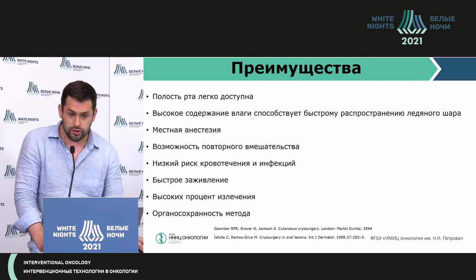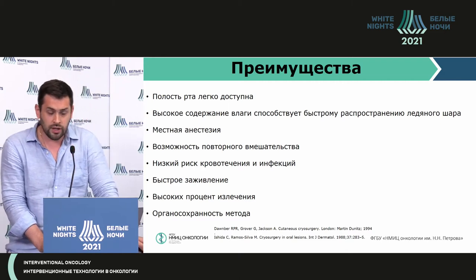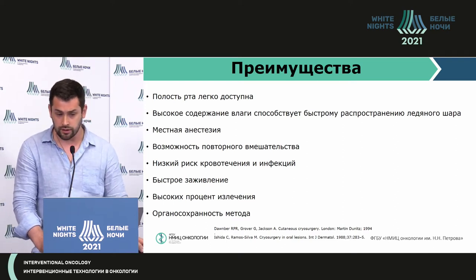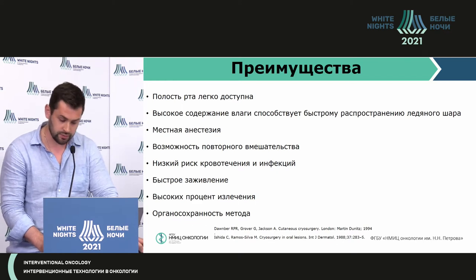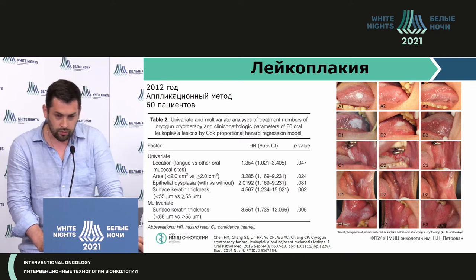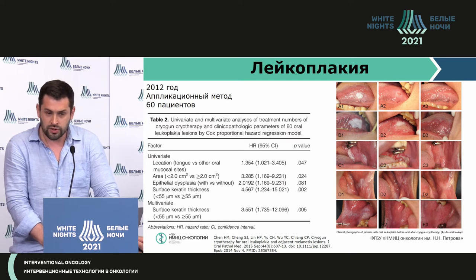Advantages of cryodestruction. The oral cavity is easy to access. High humidity allows for the fast distribution of the ice ball. Local anesthesia is possible. Recurrent interventions are also possible with reduced bleeding risk and infection risk and fast healing of the post-surgery suture. High percentage of cure and organ-saving intervention.